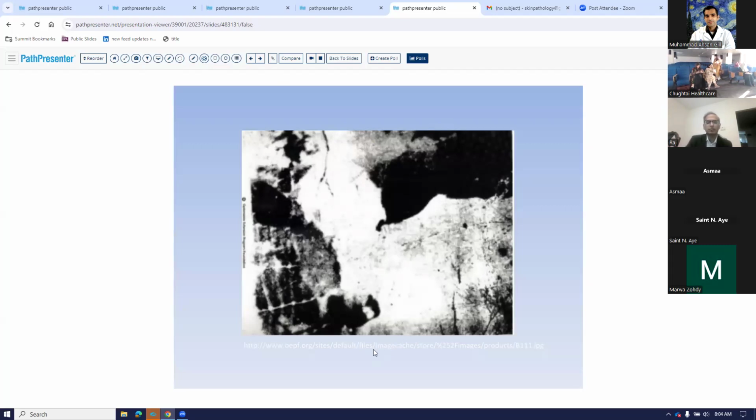If you look at this image, what do you see right now? Many of you might just see black and white blotches, because your mind doesn't know what to see here. But if I tell your mind that this is the outline, it is a cow that you can see here. Now, because I've shown you this and your mind knows that I'm looking at a cow, your eyes will easily see it here. If you go back and look at this image again, you will easily see the cow now. But previously it was difficult to see the cow. So if your mind doesn't know, your eyes will not see it even if it is in front of you.